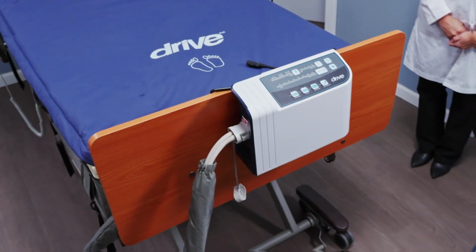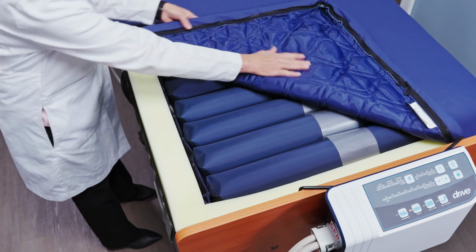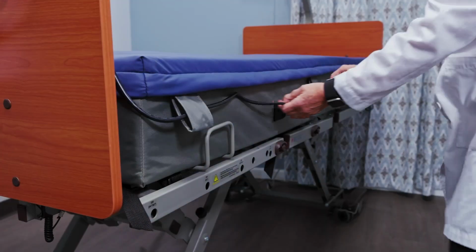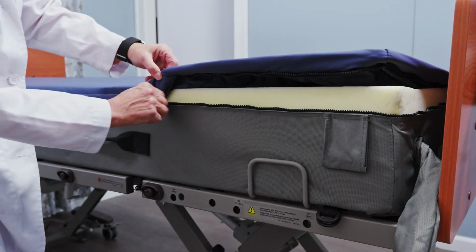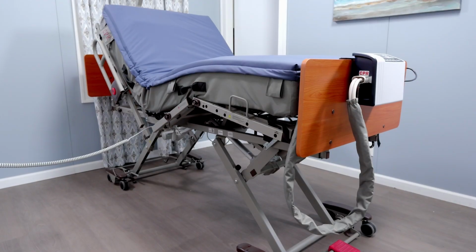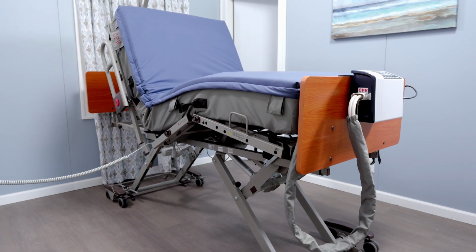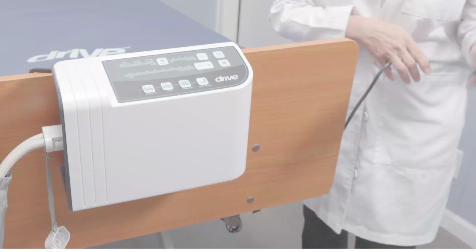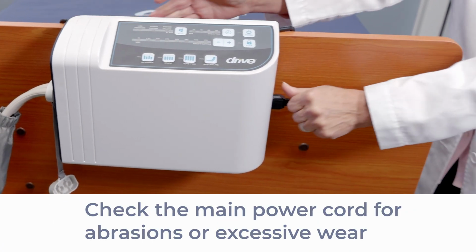Maintenance. Your facility owns Drive DeVilbiss's Preserve Tech MedAire Edge mattress replacement systems, which are designed and intended to offer safe and reliable therapy when installed, operated, cleaned, and maintained according to the instructions provided by Drive Medical. If the following simple, quick, and easy maintenance tips are followed, service of the Preserve Tech MedAire Edge shouldn't be required. Check the main power cord and plug for abrasions or excessive wear.